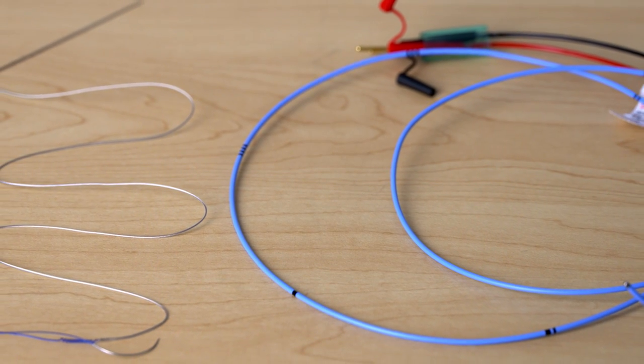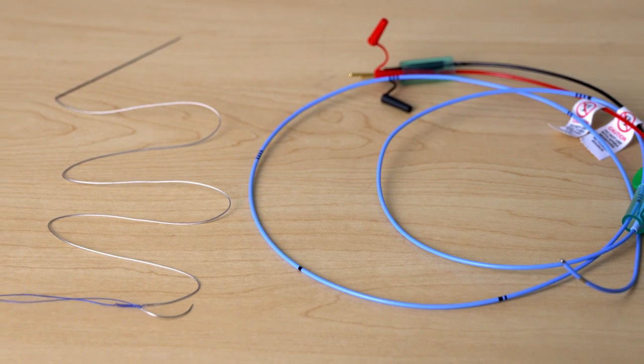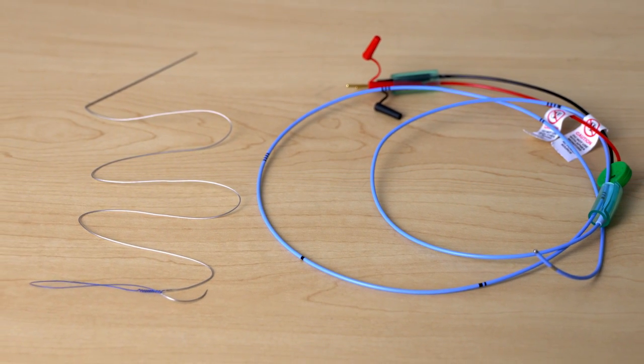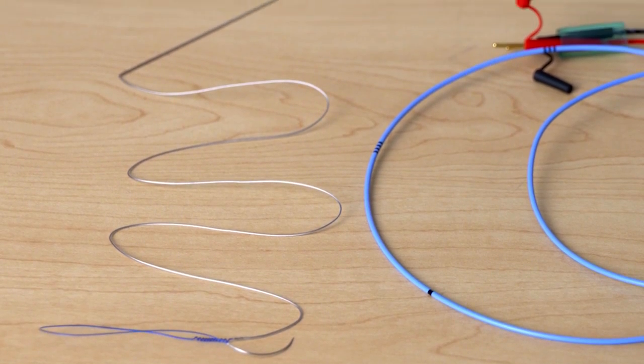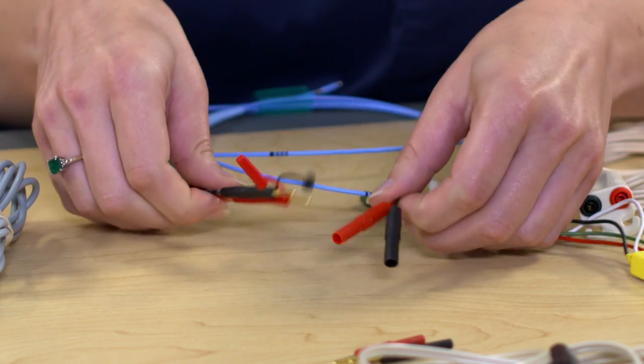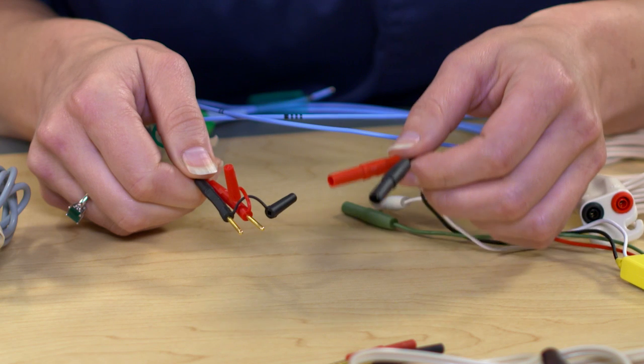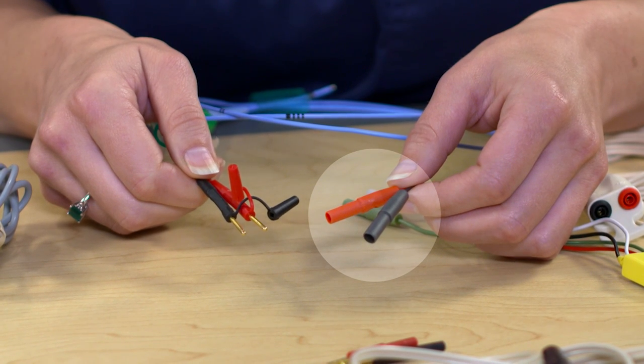These wires and leads connect to a cable which connects to the external pacemaker — pacing leads or heart wires don't go directly into the external pacemaker. A cable is always needed to connect the pacing catheter, lead, or heart wire to the external pacemaker. As you can see, the ends of the heart wire, temporary pacing catheters, and leads look very different. These are called unshrouded pins because they have exposed pins, and these are referred to as shrouded pins.